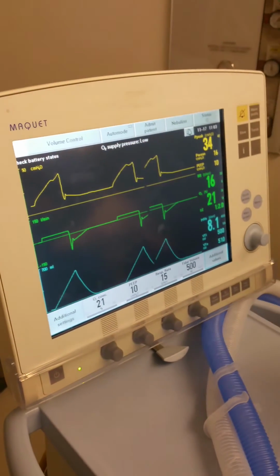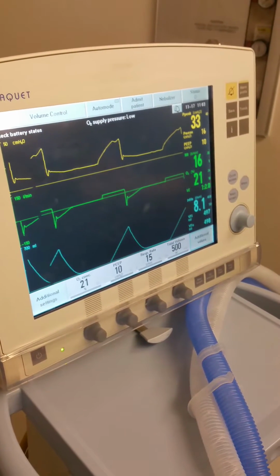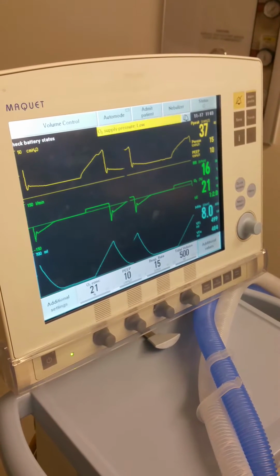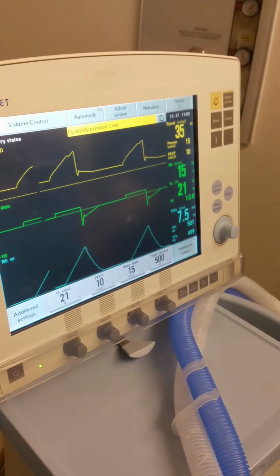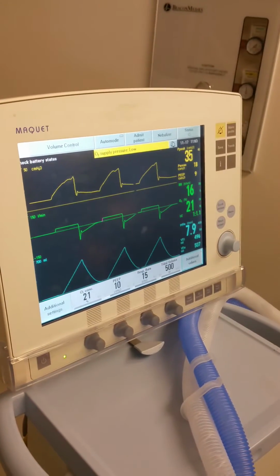So you can see what's going on here. You have a rate of 16, and let's say that's been adequately ventilating the patient, like their CO2 has been okay, but their oxygenation is now dropping. We're at 100%. Their PO2 is really poor. You send off a gas, and they're coming back at like 50. So the doctor wants to switch over. So go ahead and switch it over to Bilevel.